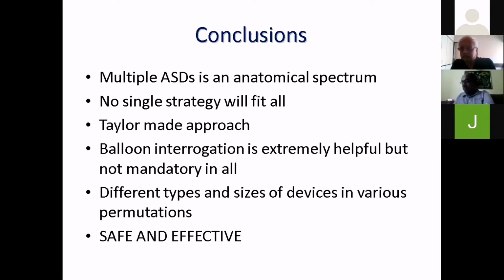There are a few questions that came up and I am just reading them out. One of the question was, while we are advocating a balloon interrogation, which means you are stretching the balloon a little bit beyond what is the stop flow, do we have the fear of tearing the interatrial septum? Dr. Srinivas is asking. I think the chances of you tearing the interatrial septum with a sizing balloon is minuscule. We have really never seen a tear in the interatrial septum only because of the use of the sizing balloon.